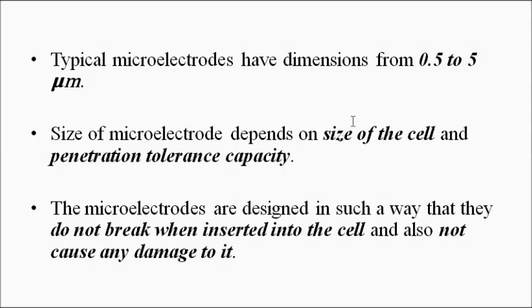First and the most important is the size of the cell. It has to be small as compared to the size of the cell, and the cell should be able to withstand, tolerate the penetration by the microelectrode. It should not cause any damage to the cell. Otherwise, what's the point if we damage the cell itself of which we want to measure the biopotential? So no damage should occur to the cell. As I said, they are designed in such a way that they do not cause any damage.